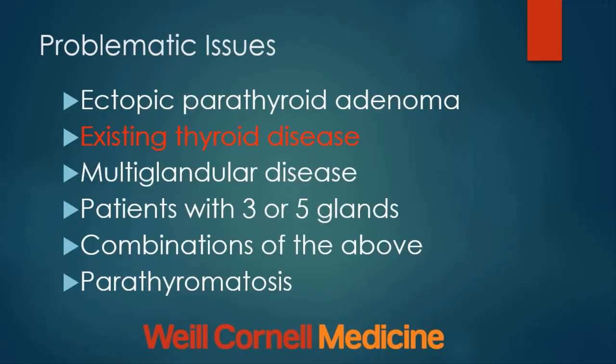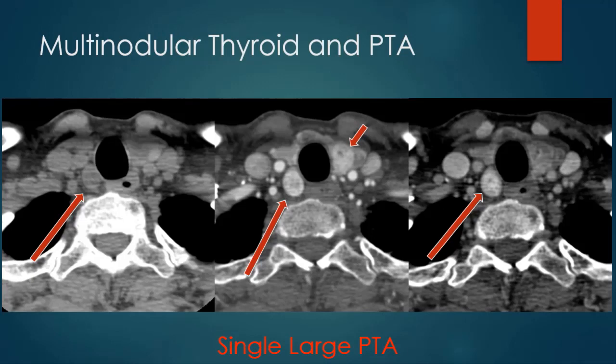The next problem issue: patients who have existing thyroid disease. This patient had a multi-nodular thyroid but hyperparathyroidism. There is a fairly large lesion in the right tracheoesophageal groove that is hypodense, enhances uniformly, but with not much washout. Also note in the left thyroid gland there is an intrathyroid lesion — intrathyroid adenomas do occur. My interpretation was likely a single large parathyroid adenoma, but if parathyroid hormone levels did not fall on resection, the left intrathyroid lesion could represent another parathyroid adenoma. This was surgically confirmed as a single large parathyroid adenoma, and the thyroid nodules were left alone.